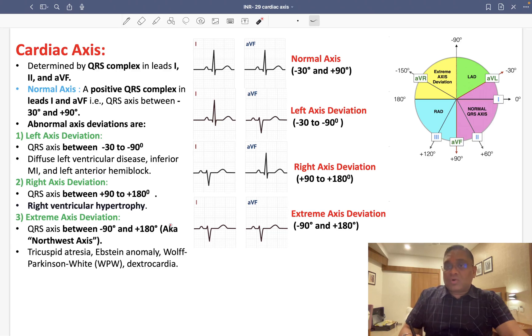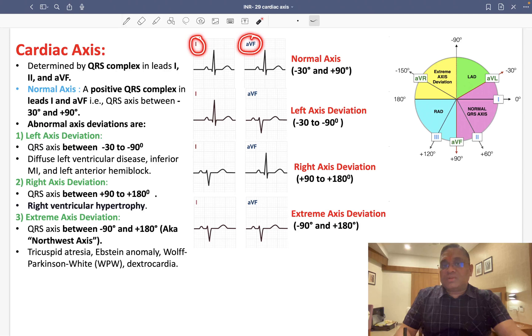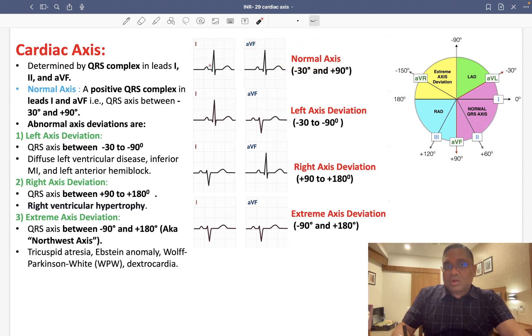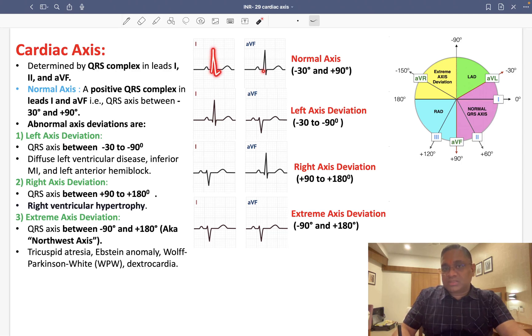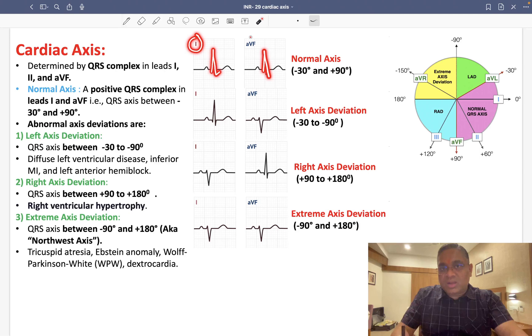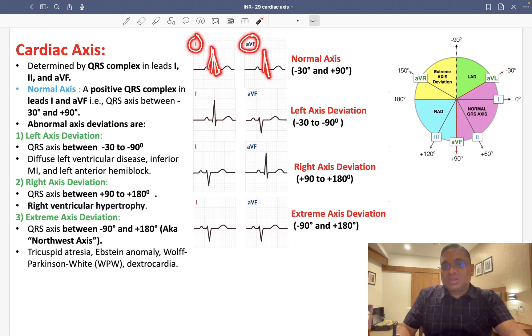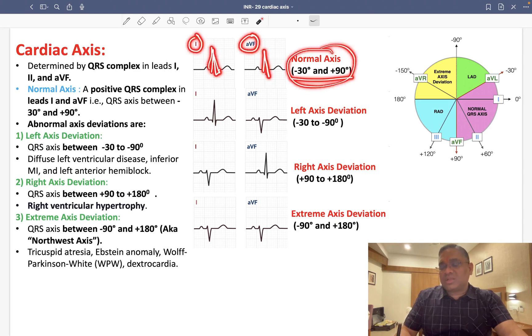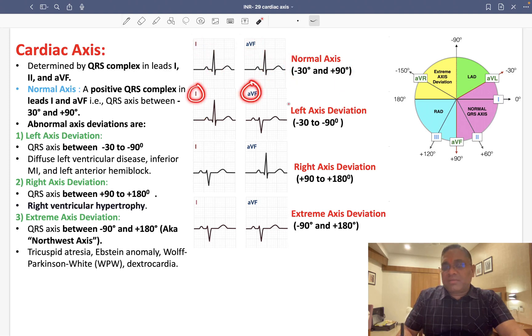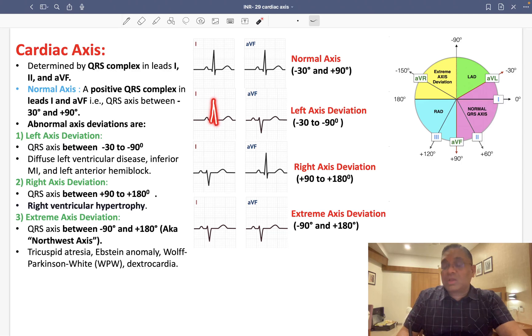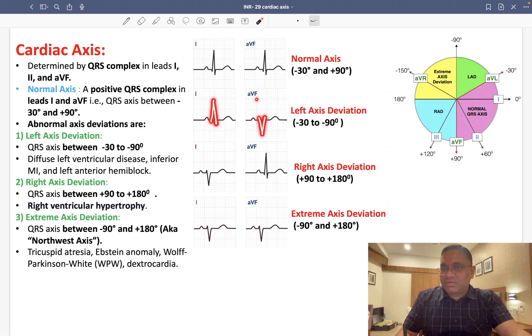When reading an ECG, we focus on two leads: lead 1 and lead AVF. For normal axis, both QRS complexes will be going upward — positive deflection in both leads 1 and AVF, ranging from minus 30 to plus 90 degrees. For left axis deviation, lead 1 QRS will have upward (positive) deflection, and AVF will have negative deflection — that is minus 30 to minus 90, left axis deviation.